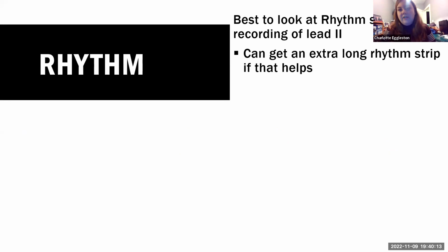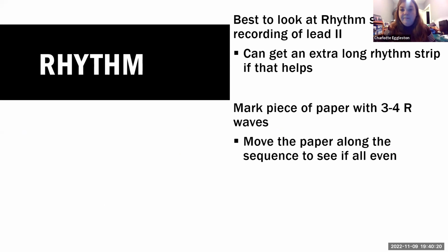You can also order an extra long rhythm strip on your ECG that can often last up to a minute. So again, you can look out for those signs that things are going irregular.